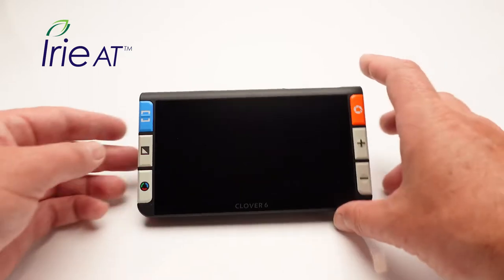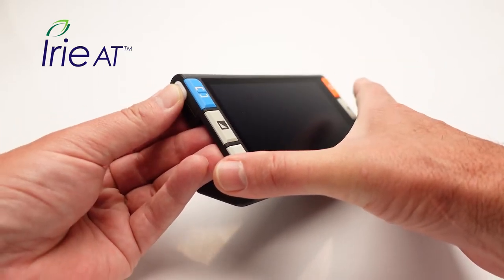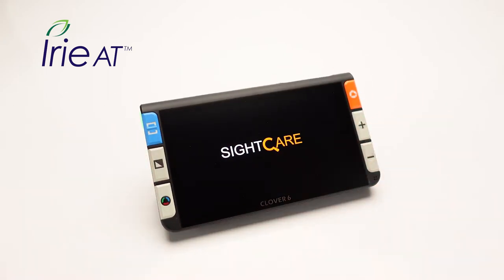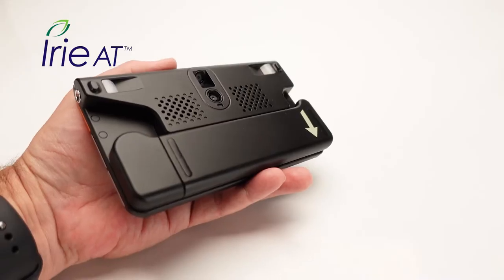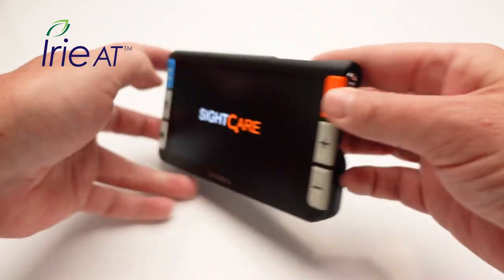There are a couple of ways to turn on the device. One is to press the power button on the top left side — just hold that down for a couple of seconds. It'll turn green, give you a vibration, and then the device will come on. You'll see the SightCare splash screen, the Clover 6 splash screen, then the LED lights come on and the device will be ready to use. You can also turn on the Clover 6 just by pulling down the handle into the reading position.